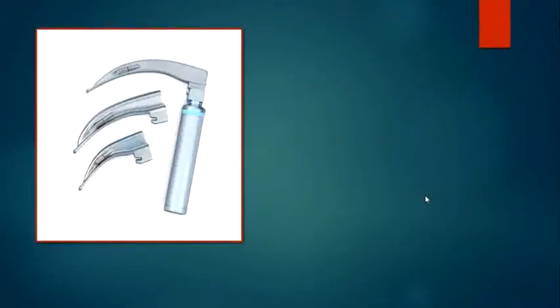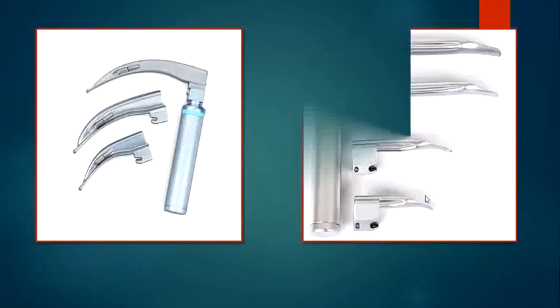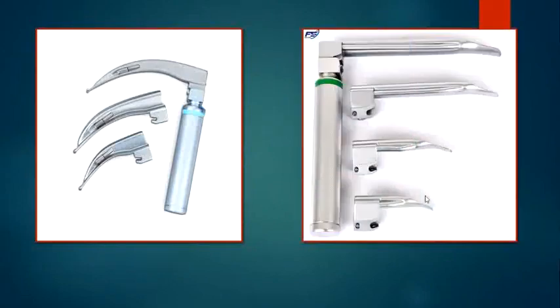Now we will go to another instrument, and I think it's clear to you this is a laryngoscope. You can see here the difference between these laryngoscopes. This is a curved one, and this is a straight one.